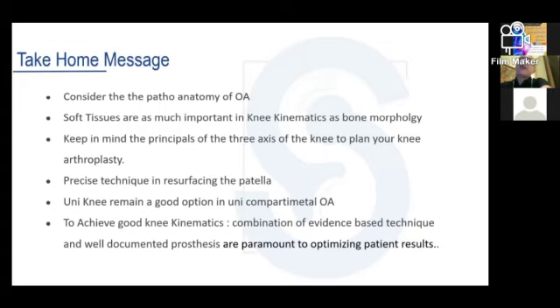In neurologic problems, this is another chapter, because the patient has a very big recurvatum, and you have to correct the soft tissue problem or the deformity first, or otherwise plan to restore the normal anatomy from before, or to put the prosthesis in the physiological position.